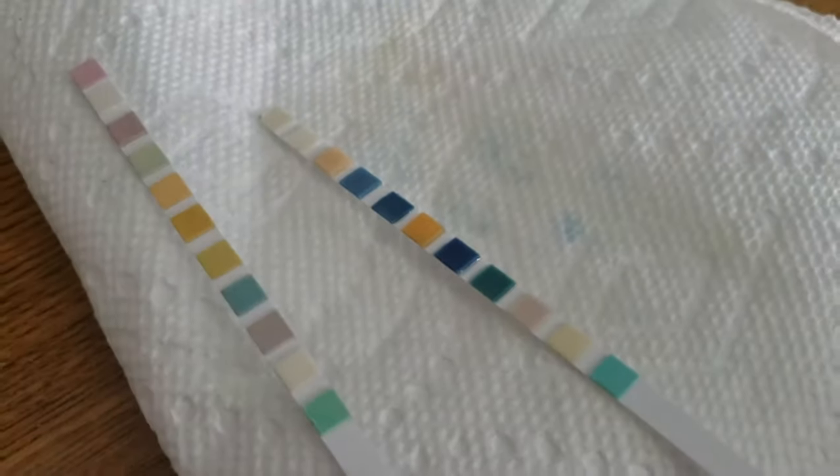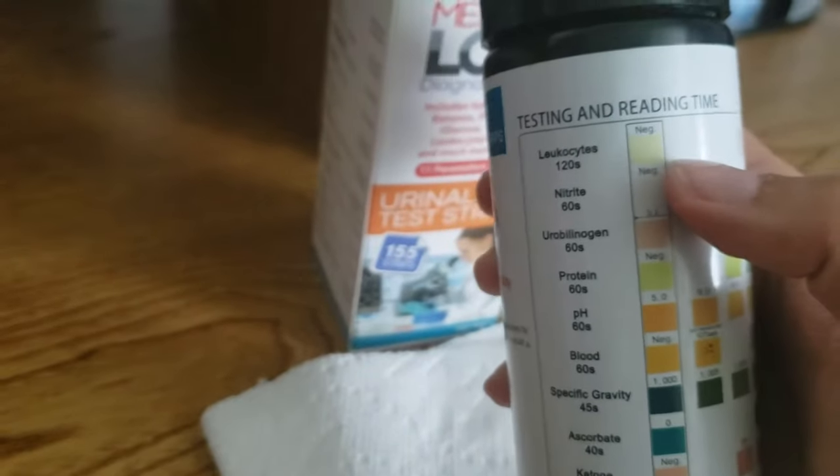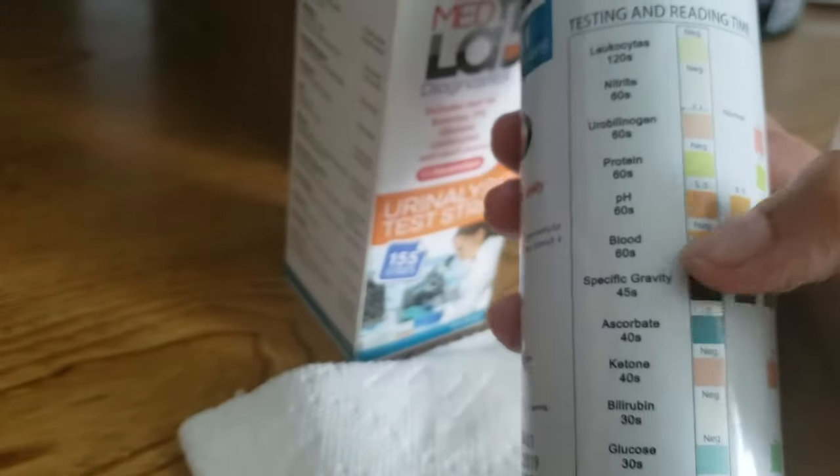You can already see the color changes starting to take place. Depending on the parameter, different ones take different times to develop. Some will develop in 30 seconds, some in 40 or 60. The leukocyte pad is the one that takes the longest — it takes two minutes. So you want to wait a full two minutes before you read that result. For the rest of them, it's just a few seconds.